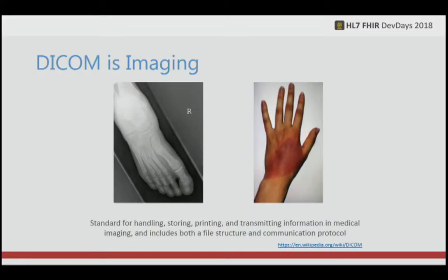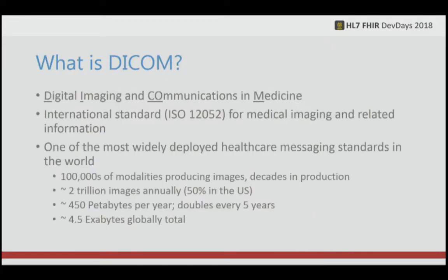So let's talk about what is DICOM. DICOM is imaging. It's the standard for handling, storing, printing, and transmitting information in medical imaging, and includes both a file structure as well as a communication protocol. It stands for Digital Imaging and Communication in Medicine. It has been around for quite some time.